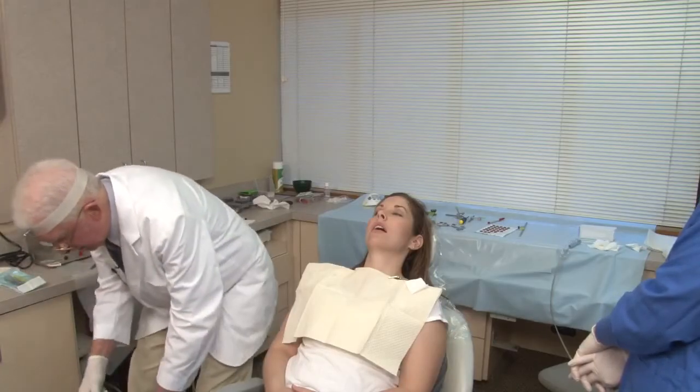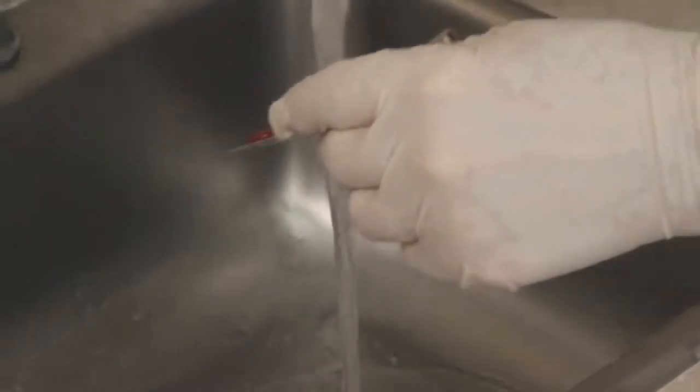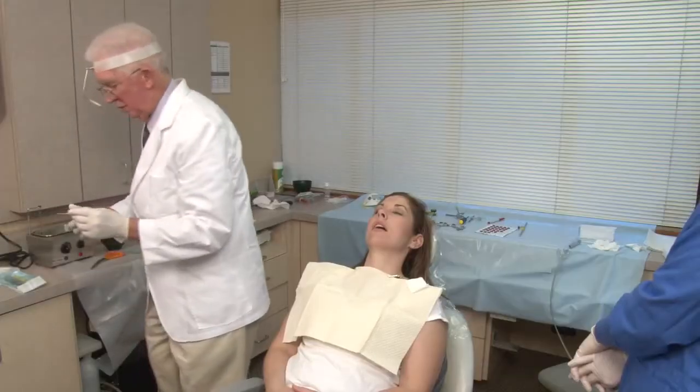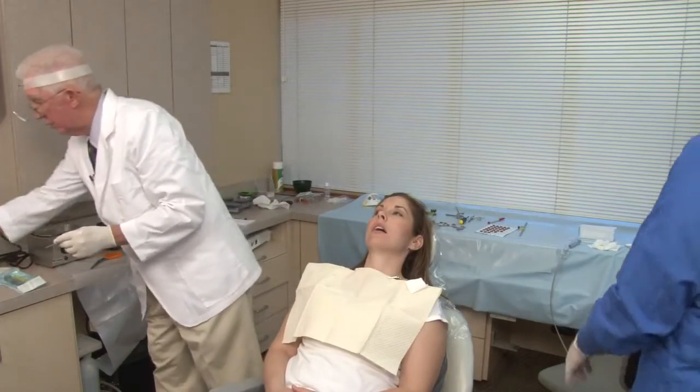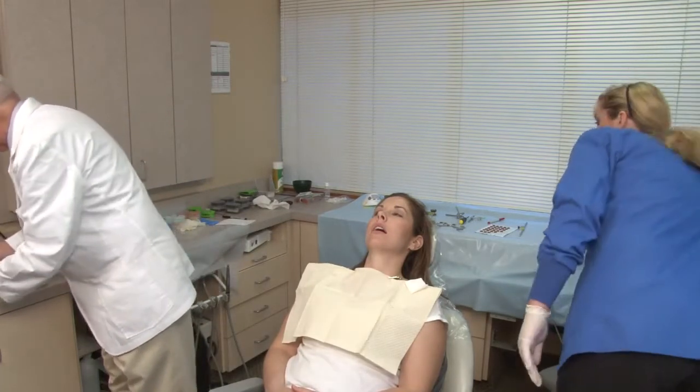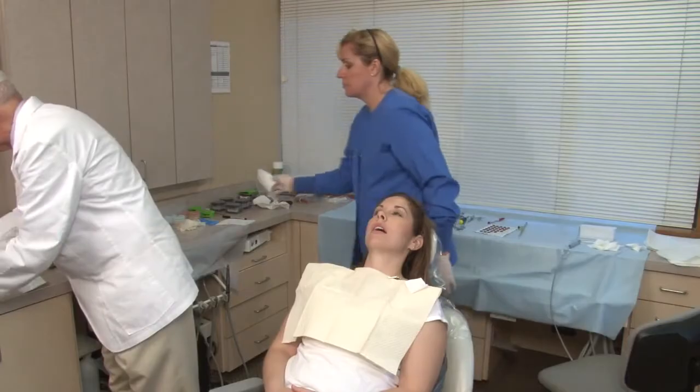Then wash it off. And we'll dry it good. Also wash your hand, your glove, because the compound, as I say, just kind of flies all over the place.